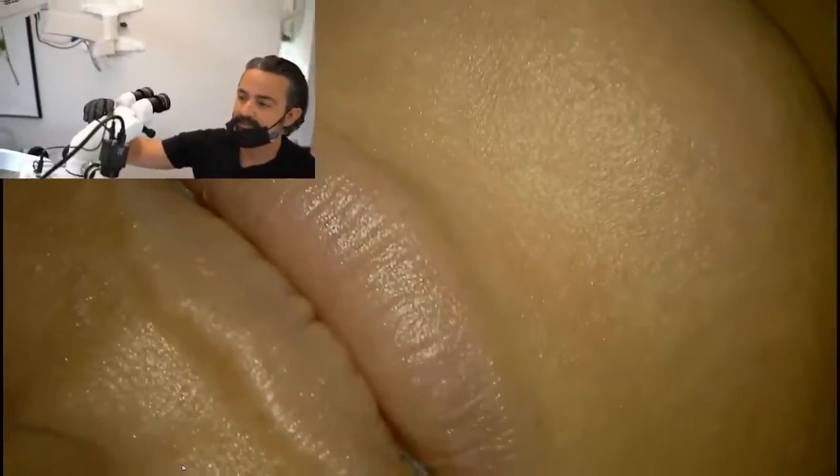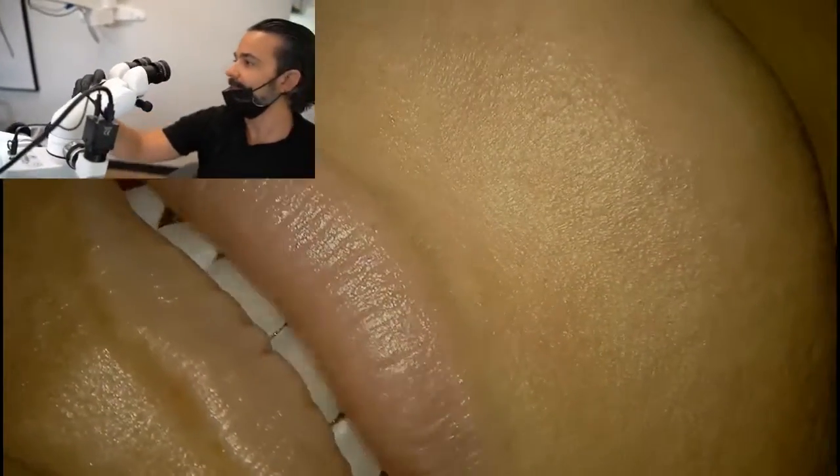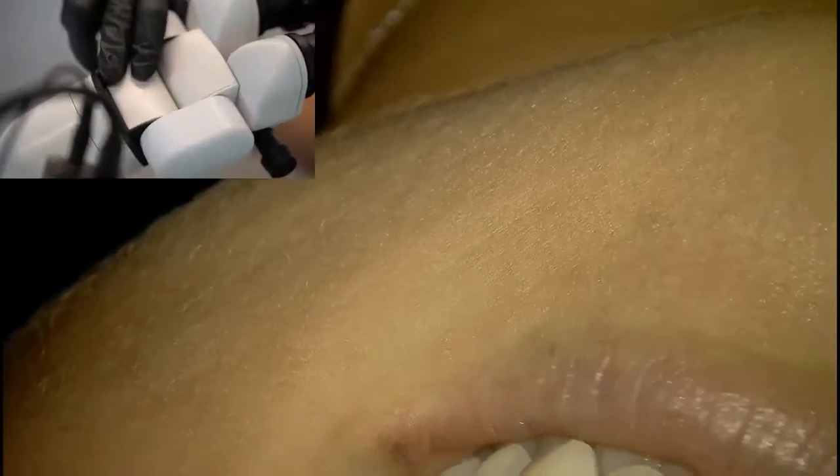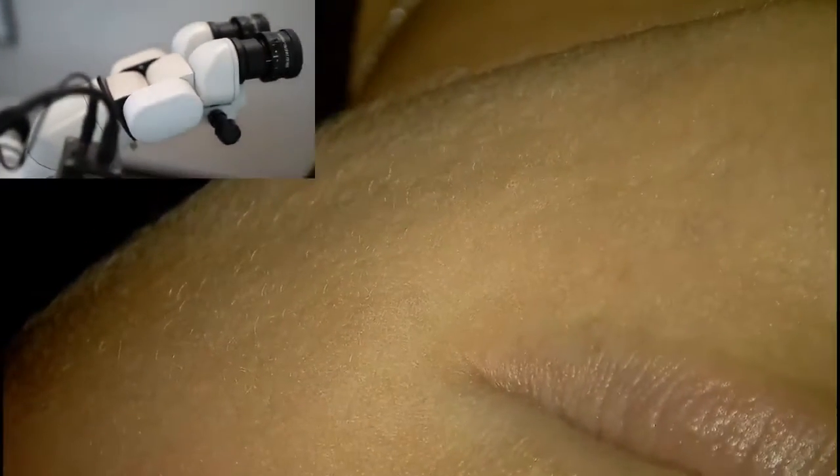Get in on that. Can you turn towards me just a little bit? Like this. Yep.